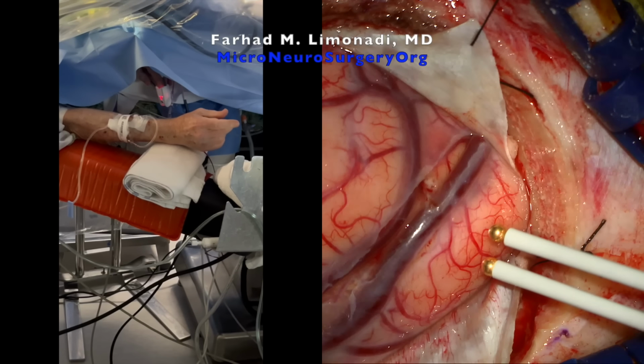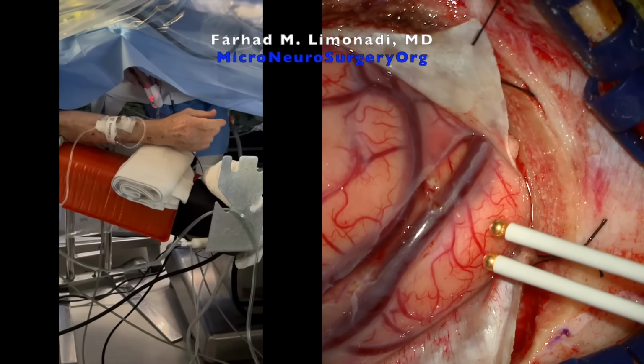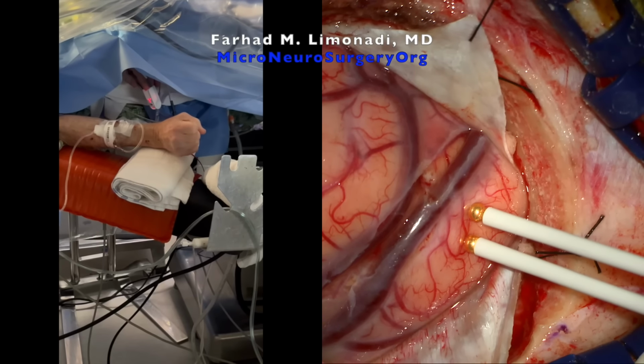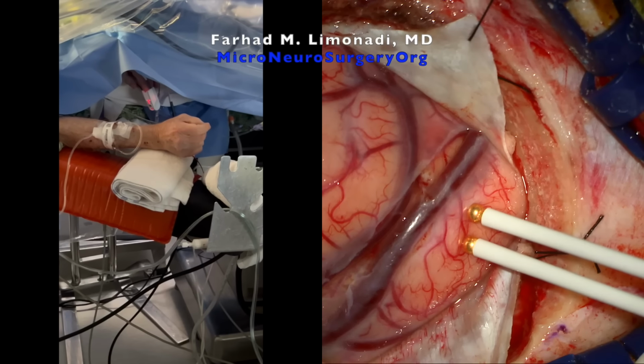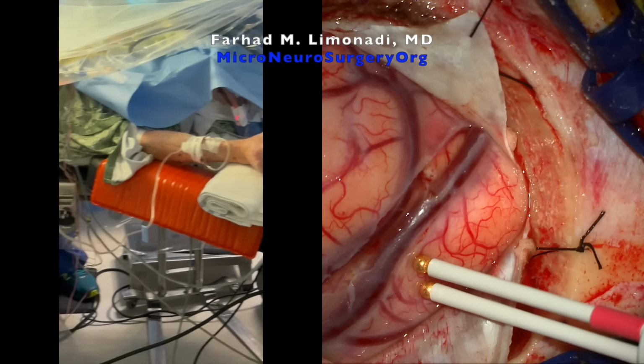You're doing really good. You're doing awesome. Do you have the microclip? Yes, I do. You're doing awesome. Okay, good. Now let's get the microclip.